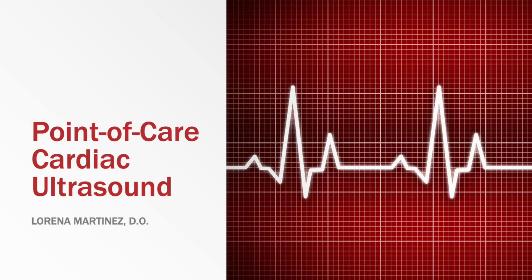Hello everyone, my name is Dr. Lorena Martinez. Today I will be teaching you the basics of performing a point-of-care cardiac ultrasound. As we go through the presentation, please keep in mind that the sonographic examples of cardiac pathology will be discussed in a separate lecture. So let's get started.